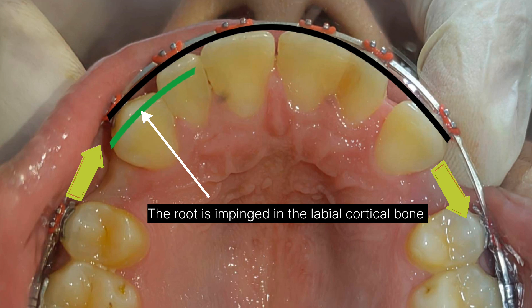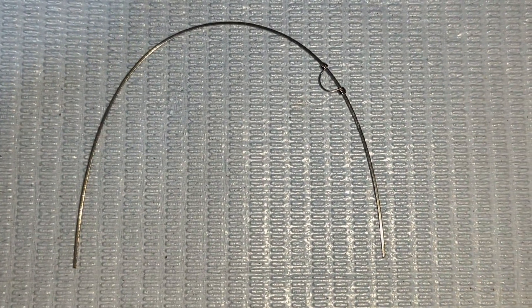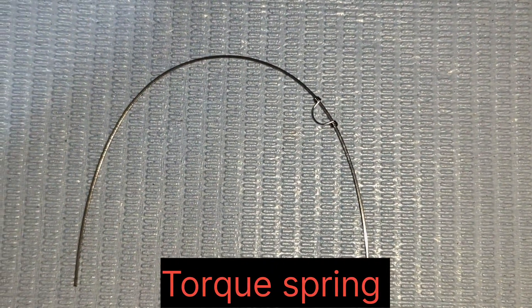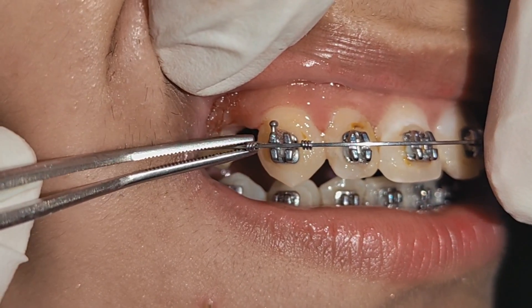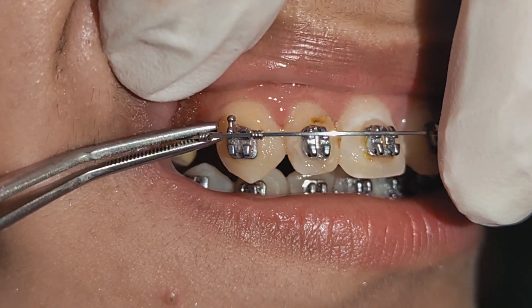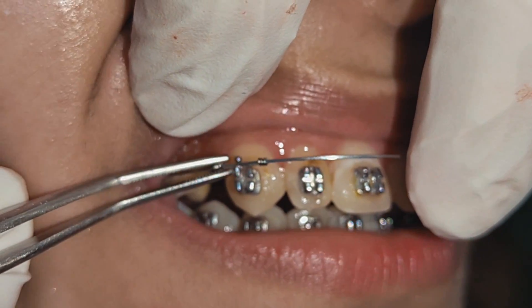You can do that by wire bending. I chose to make a torque spring. After fabrication, the torque spring must be in the same plane as the wire.